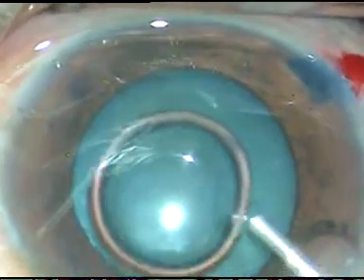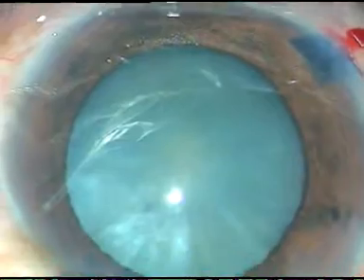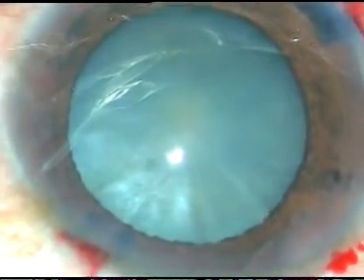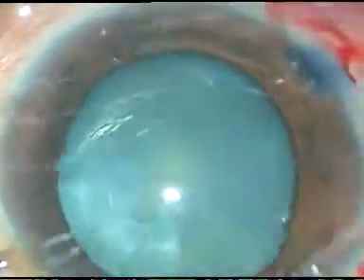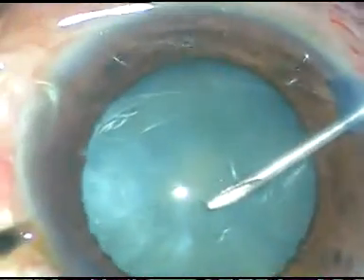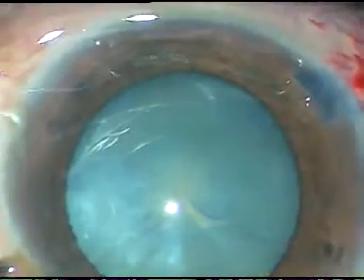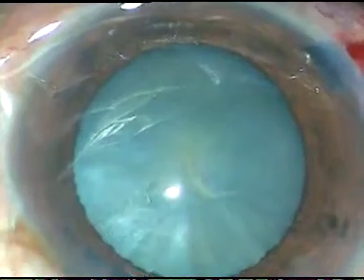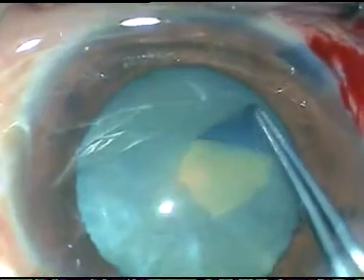Viscoelastic substance is injected into the anterior chamber. The cataract doesn't appear intumescent, and I assure that I will be able to do the rhexis in one go. After the first cut, I cut the capsule and nothing comes out — no turbid fluid, no milky fluid, nothing comes out. There is no intumescence.